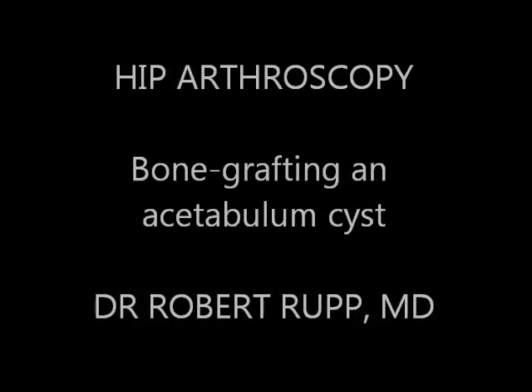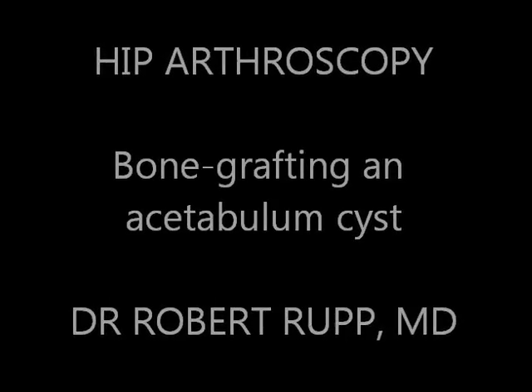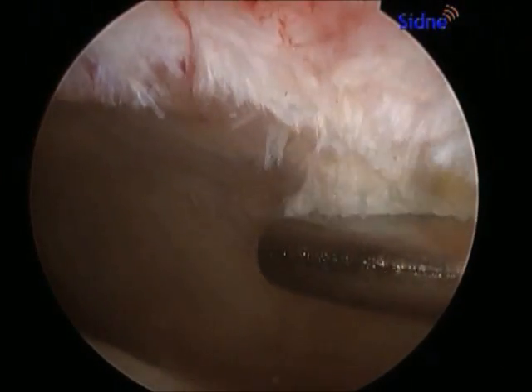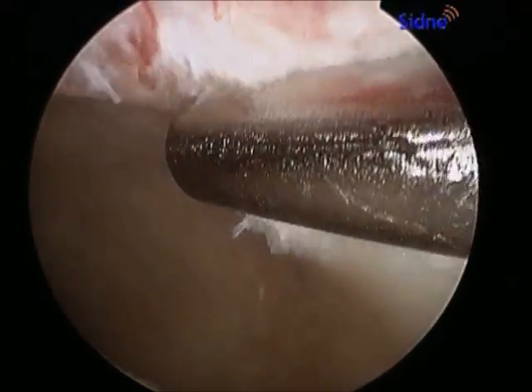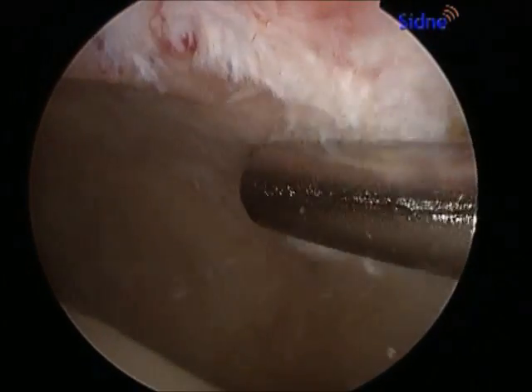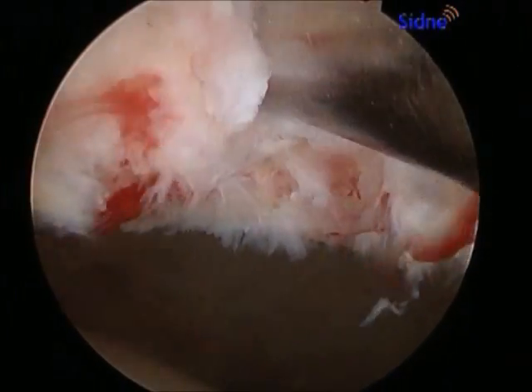This hip arthroscopy video demonstrates bone grafting of an acetabulum cyst. A shaver is introduced arthroscopically to debride a degenerated and torn hip labrum. The underlying femoral head is visualized in the lower left portion of this video.